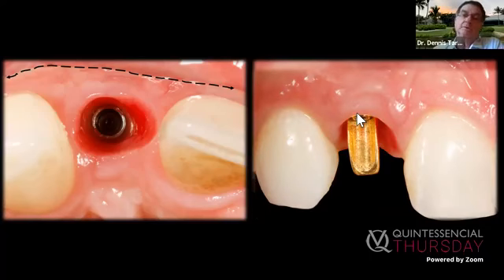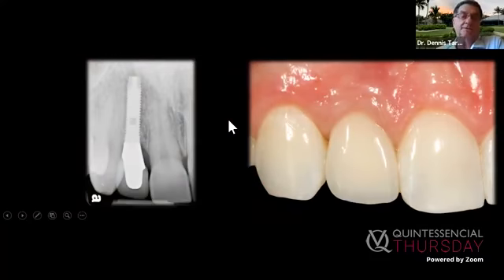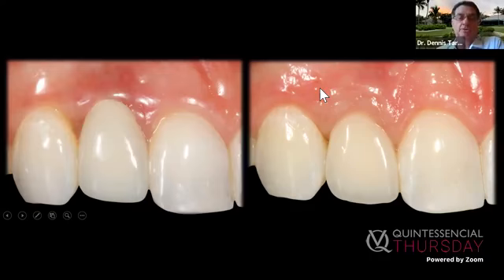Now this has to be a metal abutment. You can't use ceramic here. We gold plate it because metal is stronger and will hold up. Ceramic would break when you have the whole post sticking out. Now maybe you could put an angled abutment on this. We didn't even have the parts for some of these implants. That's a separate problem. But here's the healthy implant, and here's the final case in place. There's the final case in place. So we started with this, and we ended with this.